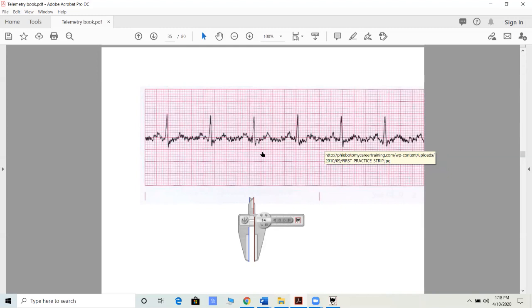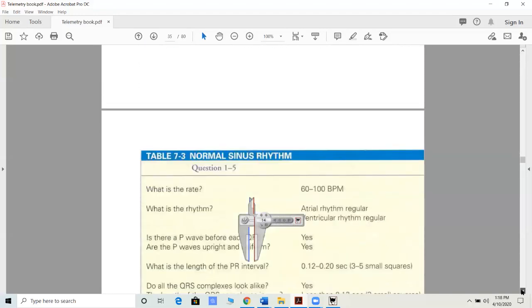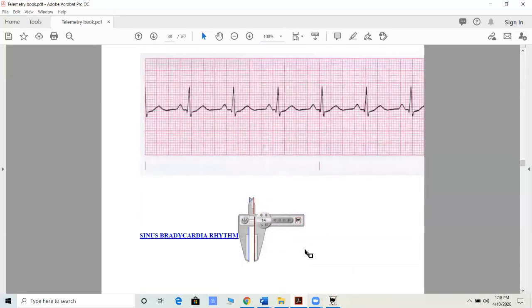But also you'll see if the patient's moving in bed, the R waves are not as stable either. So good point. All right, let's take a look at this one. All right, and let's go here. All righty, so we're gonna take apart this particular waveform.